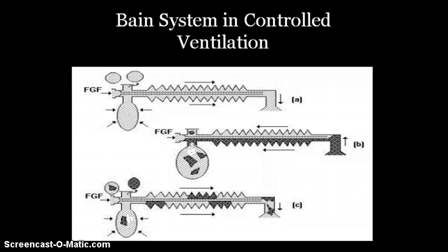As the pressure in the system increases, the expiratory valve opens and the contents of the reservoir bag are discharged into the atmosphere. Gas composition within the corrugated tube is influenced by fresh gas flow, respiratory rate, tidal volume, and pattern of ventilation, just as it is during spontaneous ventilation. The only difference is that these parameters can be totally controlled by the anesthesia provider and do not depend on the patient. Using a low respiratory rate with a long expiratory pause and a high tidal volume, most of the fresh gas could be utilized for alveolar ventilation without wastage, making for a very efficient and economical system.